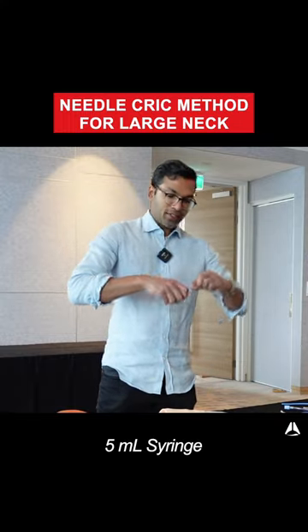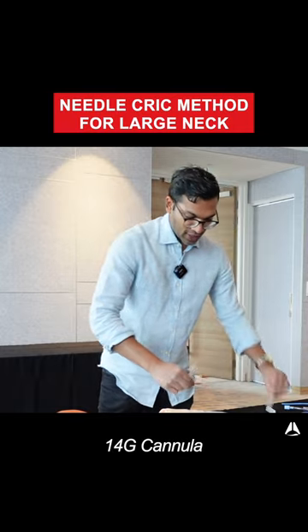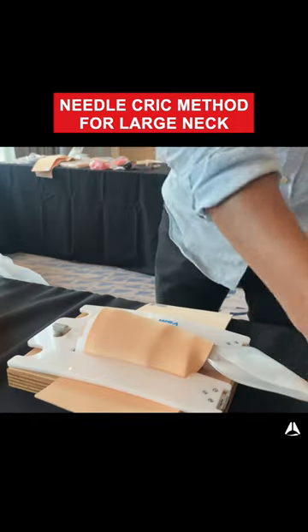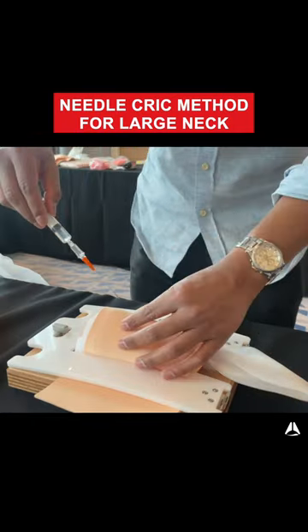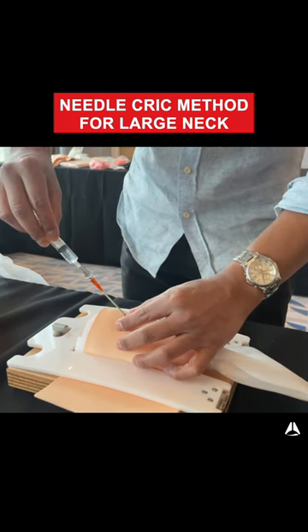Similarly, I'll take my 5ml syringe with 2ml of saline, take my 14-gauge cannula, remove the back of that. After doing the laryngeal handshake, this initial attempt is not successful.